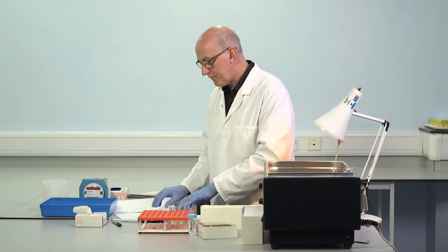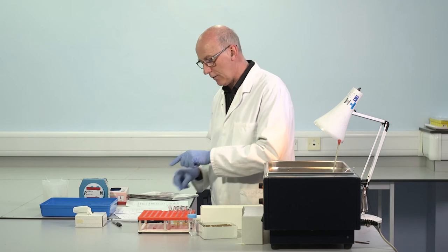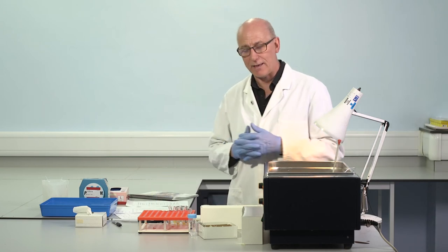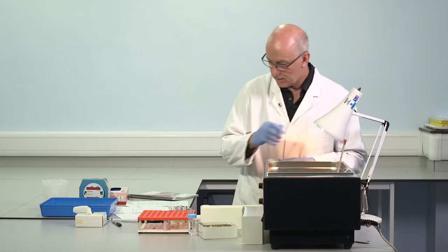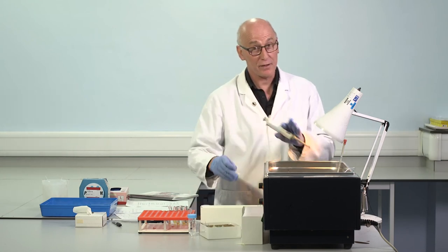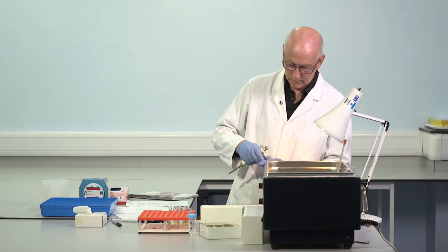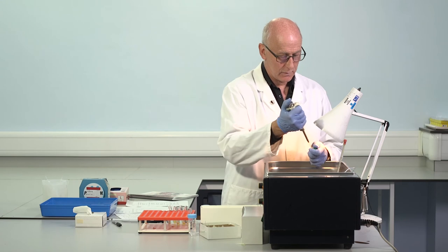So I want to retest APTT on some of the patient samples. Let's see what we get. We are compelled to do a control first. It's a different reagent. We need to be sure that this is working appropriately. So we need a normal control first.